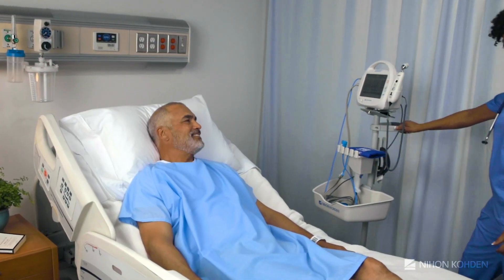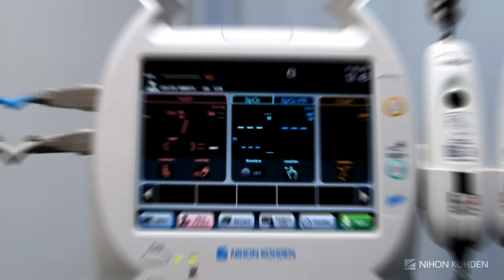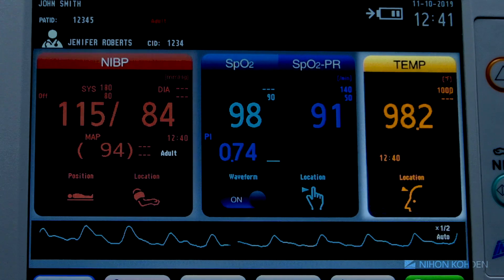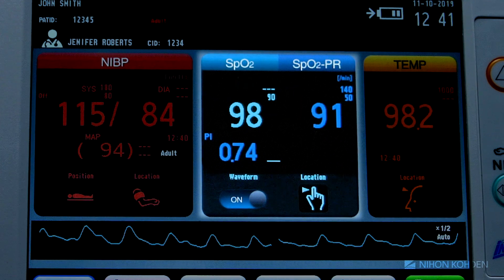Part of NeonCoden's complete line of patient monitors, the LifeScope SVM7200 performs routine vital signs measurements that are crucial to patient care, such as blood pressure, temperature, SpO2, and pulse rate.